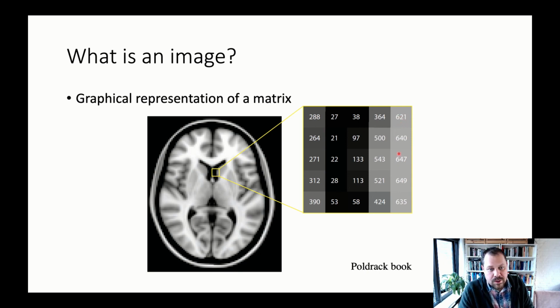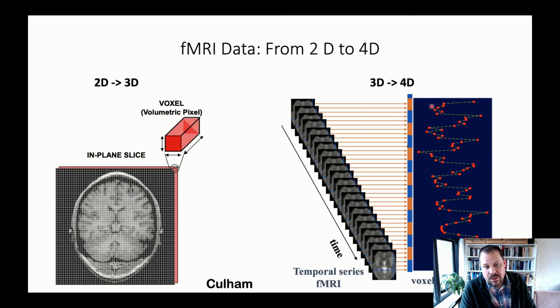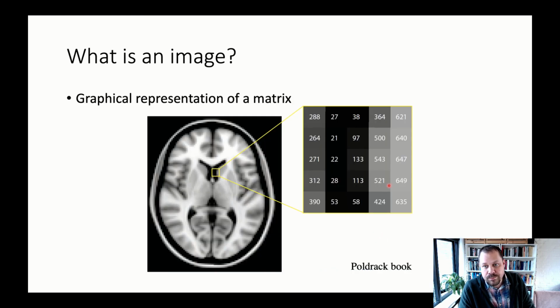So we observe these changes, which are basically levels of gray or grayscale levels in arbitrary units, but they are our signal because they reflect signal changes across time depending on our experimental manipulations. So this is the image we're working with. These are the units that we're working with here, but we do a lot to these images during the pre-processing steps.